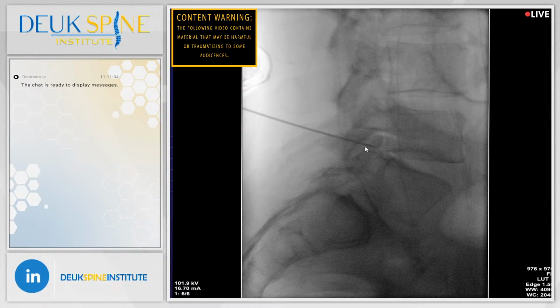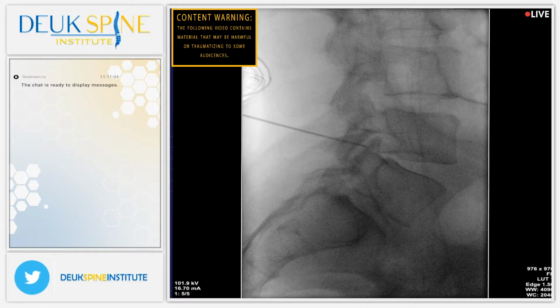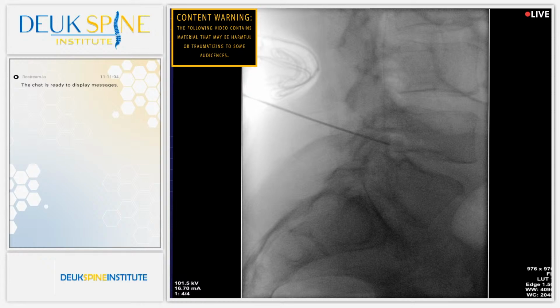So I think that L5 is really rotated on orbit. Can we de-rotate it? You see what I mean? I could be wrong. It could be just a wag issue. What do you think, Jordan? I almost feel like it's a wag. Oh, that's worse. Let's come back the other way.